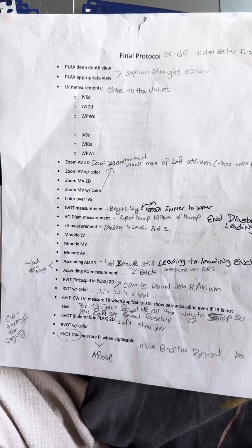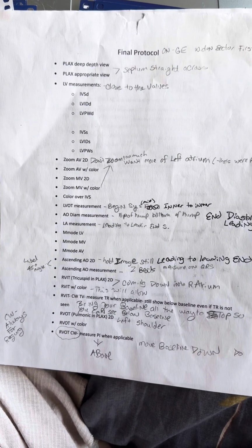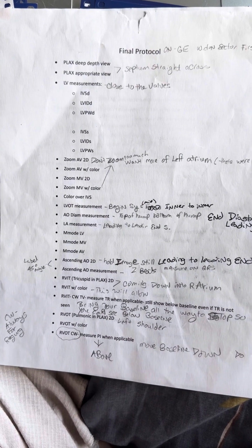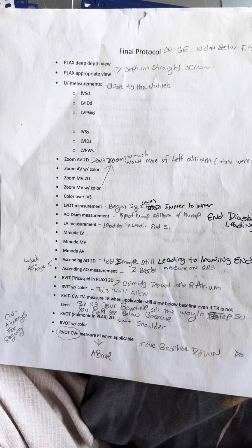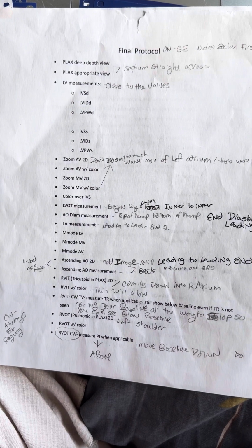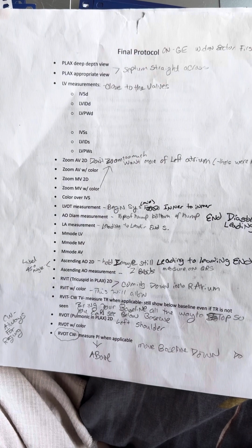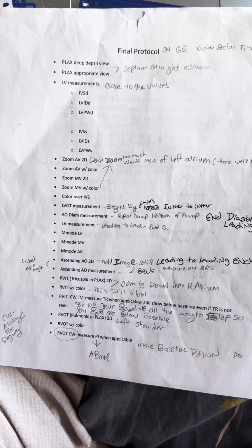Next, do your measurements in systole, IVSS, LVIDS, and LVPWS.